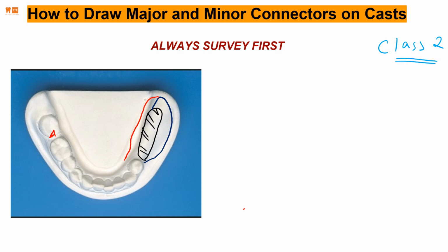Very simple, right? Okay, essentially what I'm trying to get at here is, in this case, where would the metal end? So it would be like this, and it joins, right? So if you think about it, the acrylic is here for sure, but it goes within the grid work and it touches the metal component on this side. And over here is where the metal 100% begins. So this junction is the finish line. That was my purpose here.